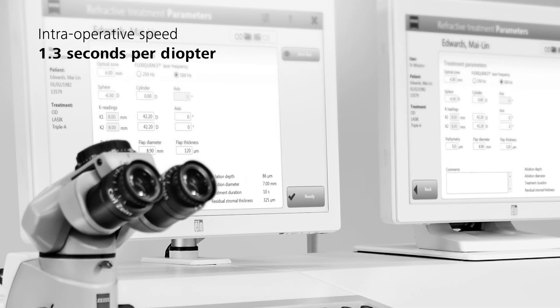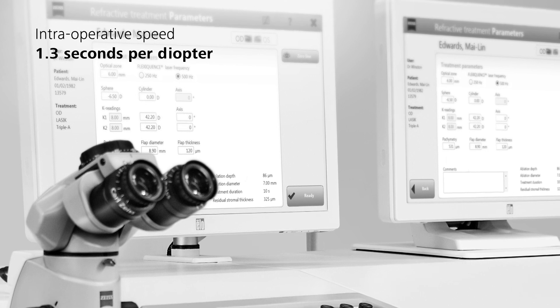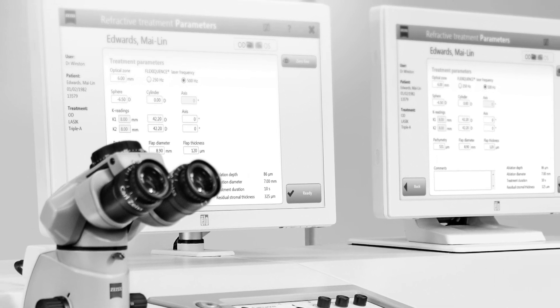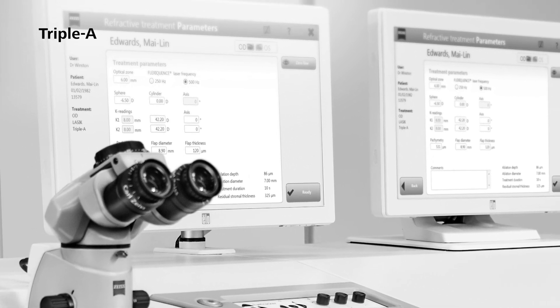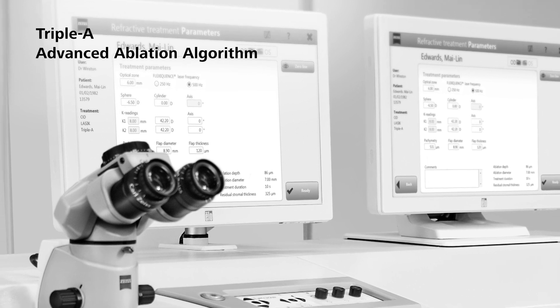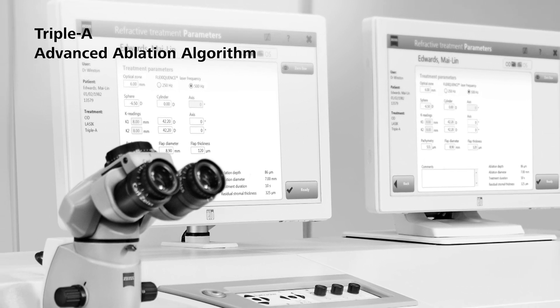Intraoperative speed: 1.3 seconds per diopter. AAA - Advanced Ablation Algorithm.